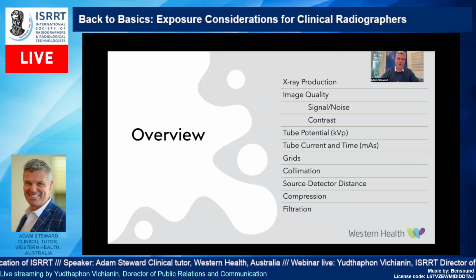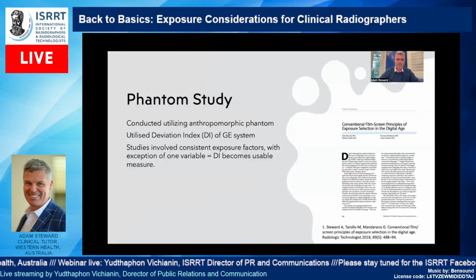I've got half a day's workshop I'm condensing down into an hour, so hopefully we get through all of it. We're going to be looking at X-ray production, image quality, and then obviously some of the factors that we can control as radiographers that are going to have an impact on the final result of our image.